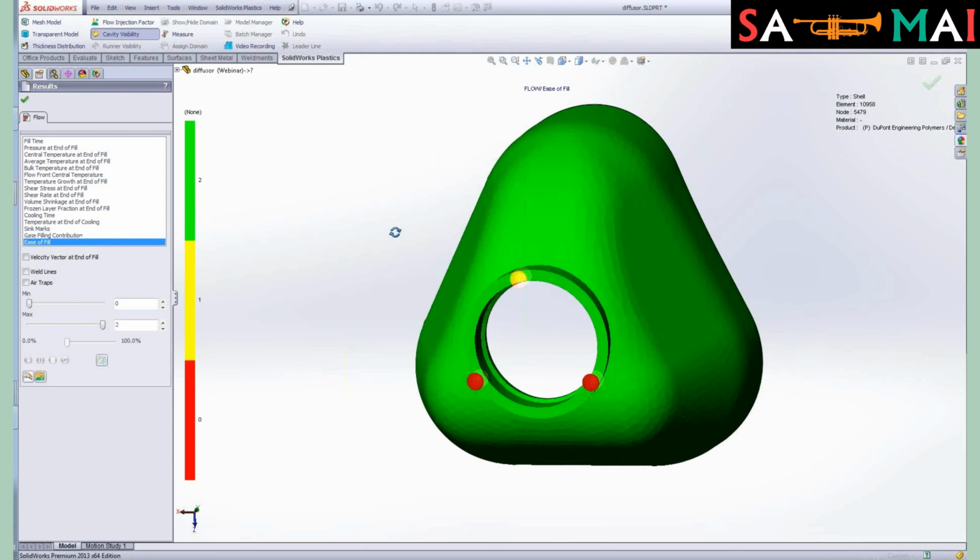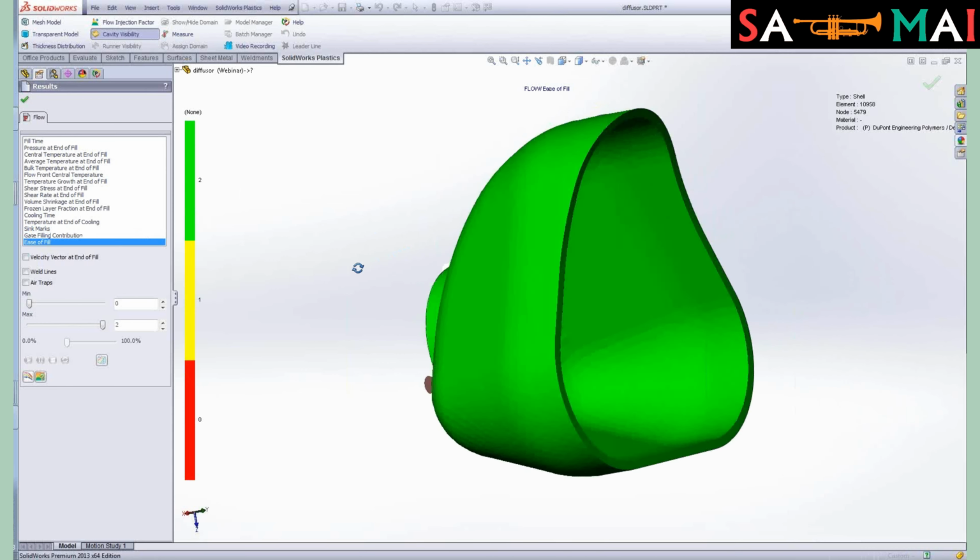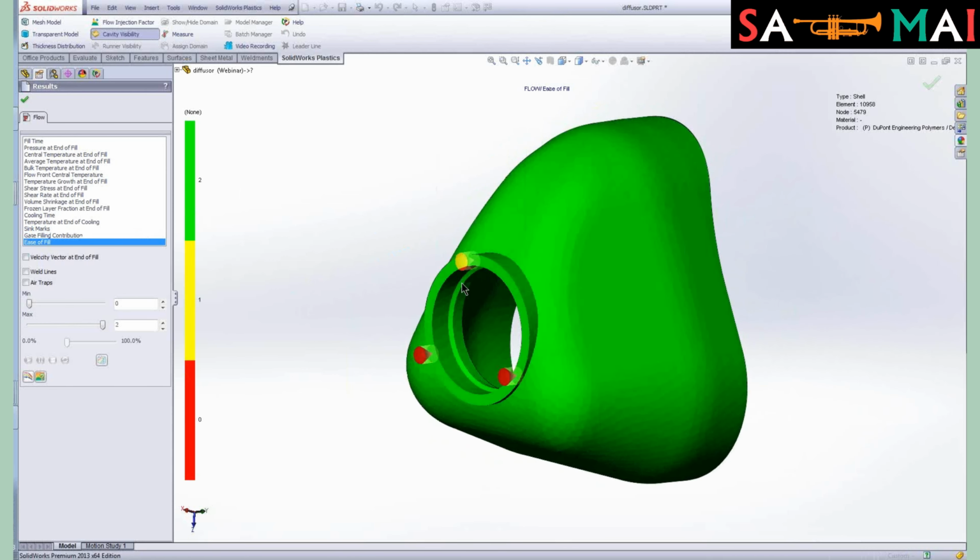Another thing that you might want to get out as a designer would be a plot called ease of fill. And what this is giving us an indication of is, based on the gate or gates and the location of these gates, how easy is it to fill the volume of the part in our injection mold tool.